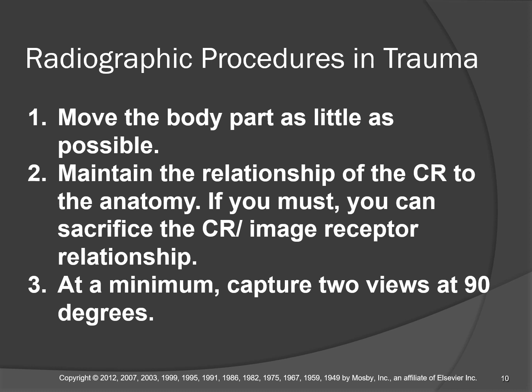So, I told you there were guidelines, there were protocols, there's a framework or a set of parameters that we follow when we do trauma, because not all trauma exams are the same. Obviously, they're different body parts sometimes, but these principles remain the same. Principle number one: you move the body part as little as possible when you're doing the radiograph.